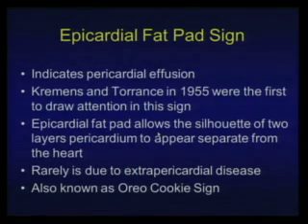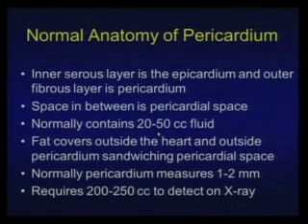And you can see it any time that you have a pleural thickening, a pericardial thickening or a pericardial effusion. Just to remind you, the normal anatomy of the pericardium is composed by 2 different layers. The inner layer, that is the epicardium, and the outer layer, that is fibrous, that is the pericardium. And in between you have the pericardial space.